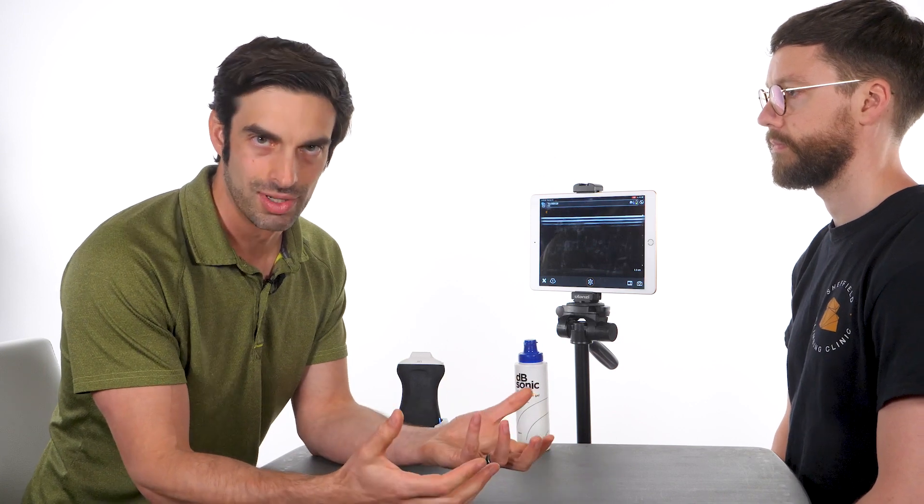I want to go over a clinical pearl that I use with the Clarius in the clinic when analyzing climbers' fingers, and in particular climbers with pulley sprains. I'm going to go through the four image capture, comparing and contrasting the longitudinal as well as transverse views, then using the measurement tool to quantify bone-tendon distance. In a case without a pulley sprain, we'll quantify the depth of the tendons. It's a great way to show patients side-by-side comparisons with their hands.